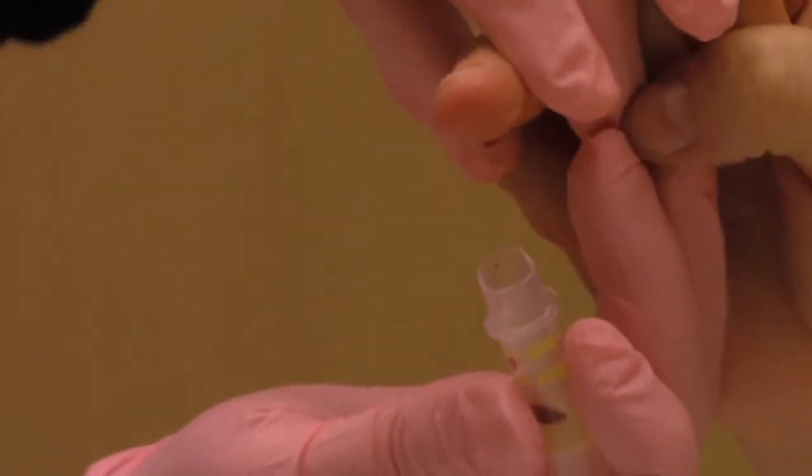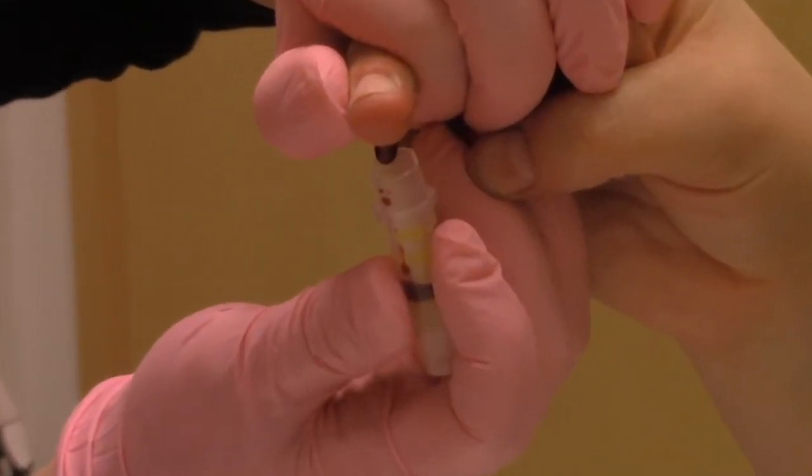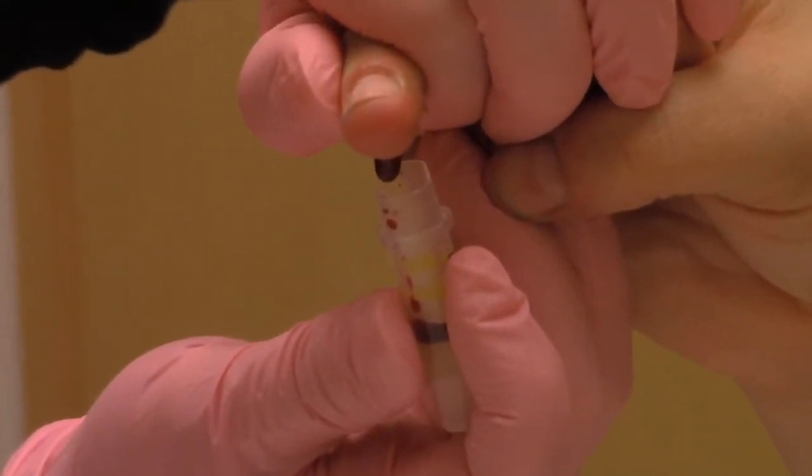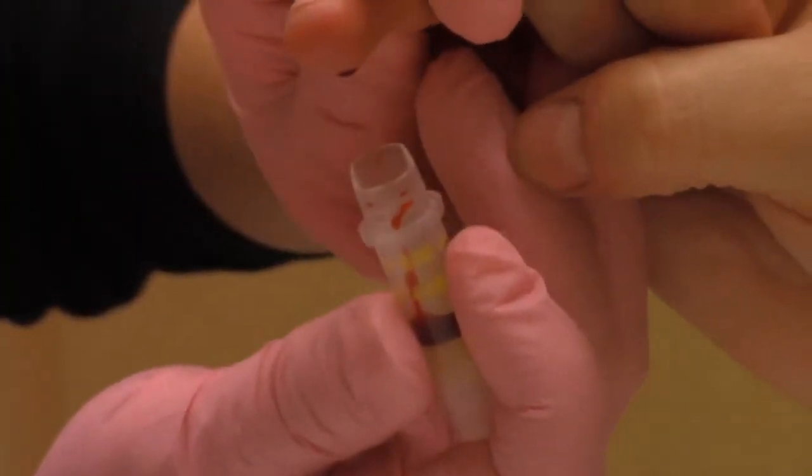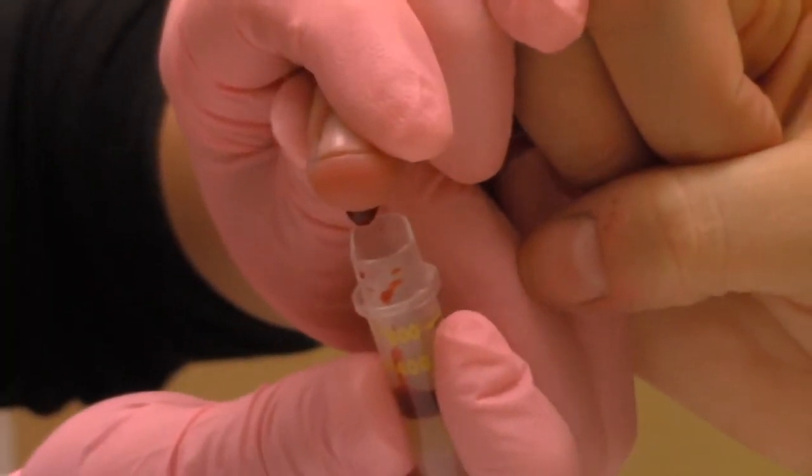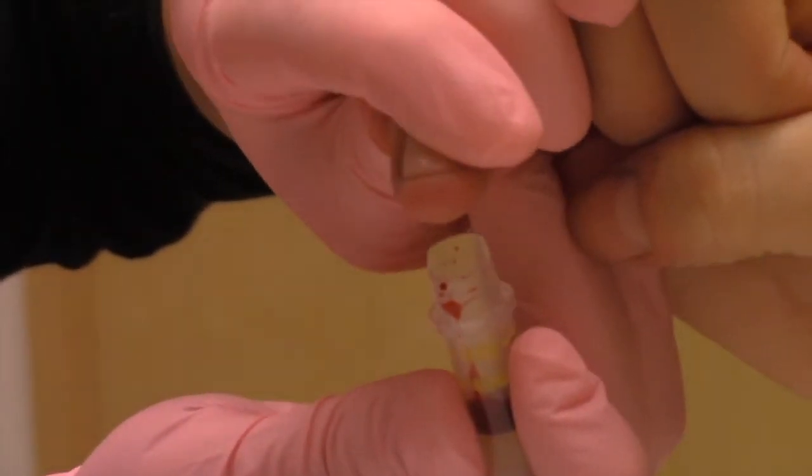Begin milking the fingertip like so and collecting the blood in the tube. If the finger doesn't seem to be bleeding enough you can hang the hand down below the heart to let gravity help with the blood flow. You can use the gauze to clean up the finger if it is getting messy and to improve blood flow into the tube.